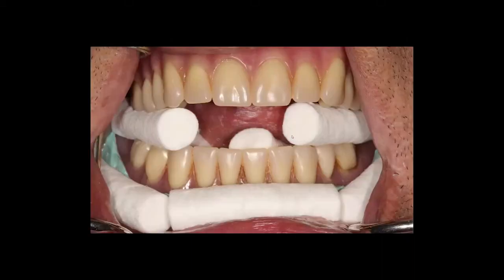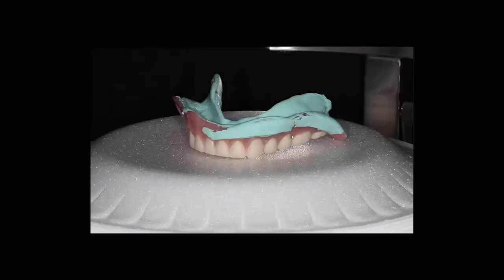Now, what we'll do is put it in the patient's mouth and scan the patient using all of the same soft tissue separation protocols that we used in our last video, but this now gives us the ability to add the denture in as an additional model. So we're going to do a dual scan protocol. We're scanning this denture by itself as well, so that'll be a second scan.